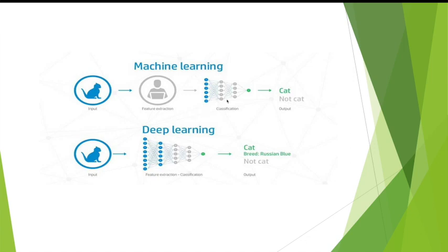Neural network is one of the artificial intelligence software tools. You can see over here that a neural network consists of different nodes and internodes. It has these connections between the different nodes. Neural network is actually inspired by the concept of the human brain, but is not a physical brain. It is virtual. It is inside a computer. It is part of a computer algorithm. Now, these are pieces of software that interact with each other in a manner which is similar to the working of the human brain. Now, these nodes are arranged in layers.